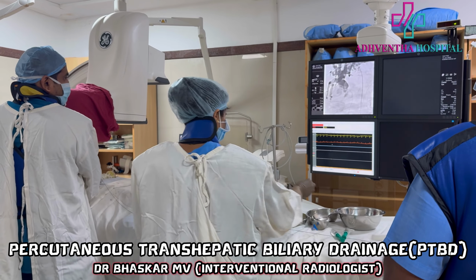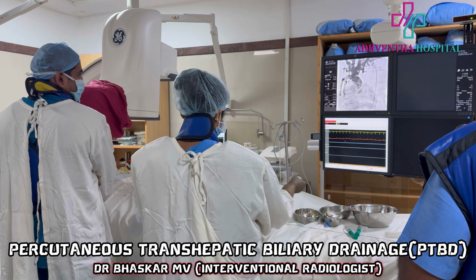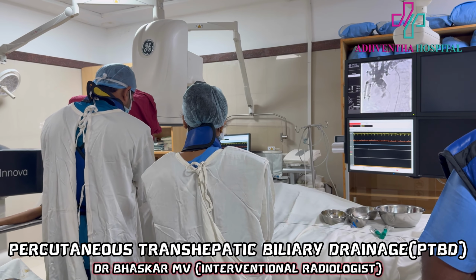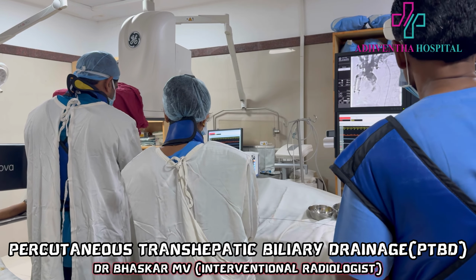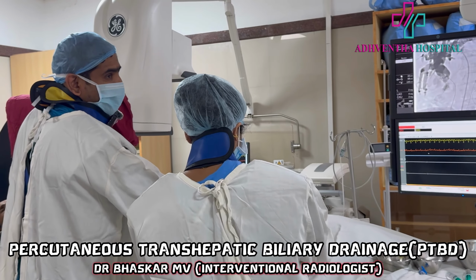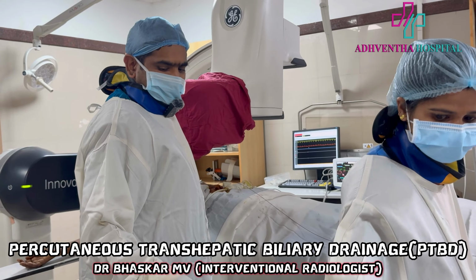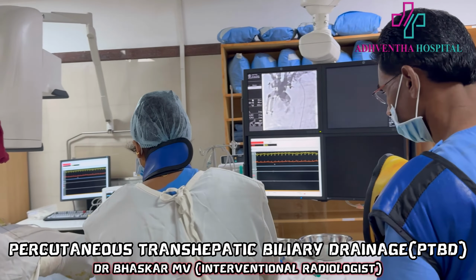You should make sure it's going in the right track. Sometimes near the entry of the capsule, the wire may get kinked. That's the reason we use the stiff wire. Of course, this will support since our catheter is small.